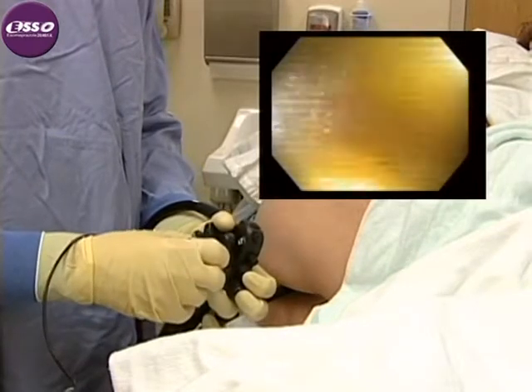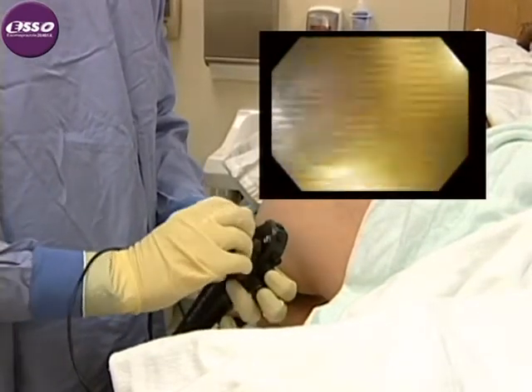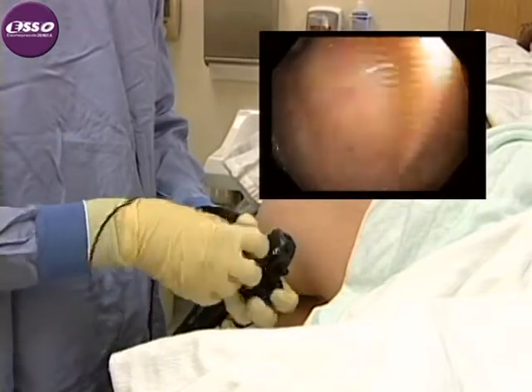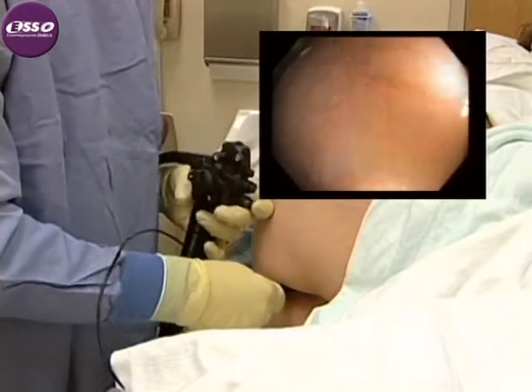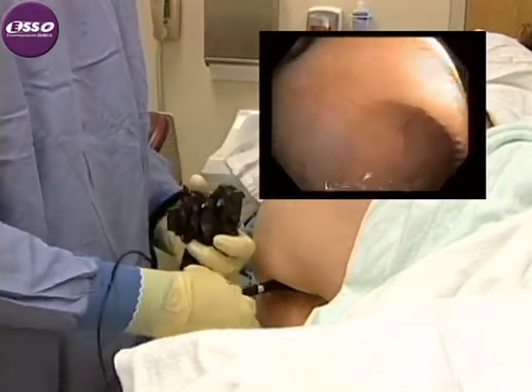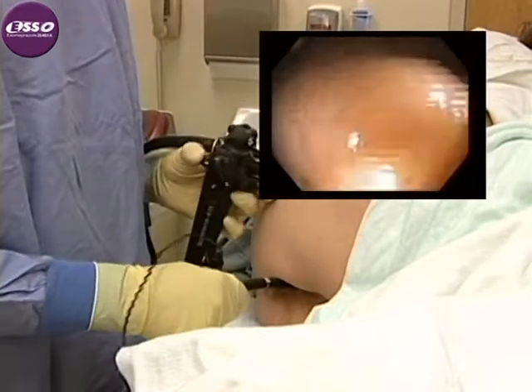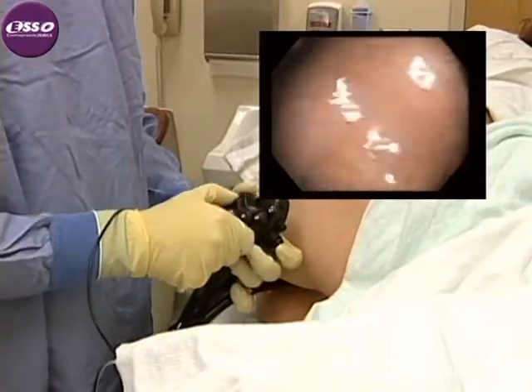You'll see me use this grip to achieve precise tip control during insertion, and in a separate DVD, I'll use it to achieve exquisite precision during the performance of complex polypectomy. The advantage of this grip, which I like to call the left-handed scope grip, is that it will allow us to achieve simultaneous insertion or withdrawal and precision control of the up, down, and right-left knobs.